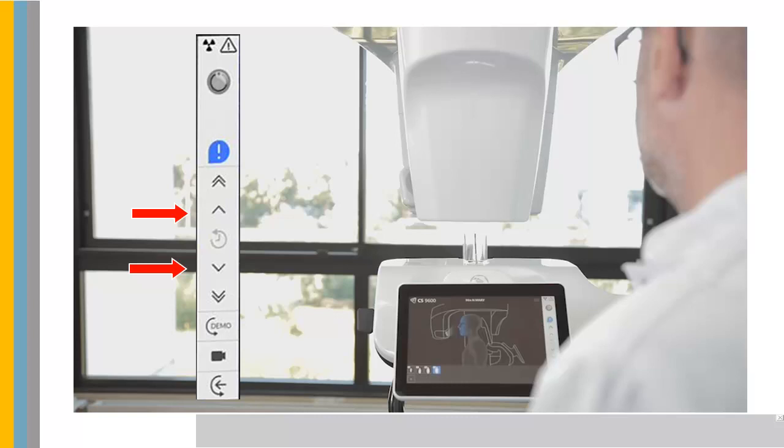On the control panel, press and hold the up and down arrows to adjust the unit to the height of the patient.